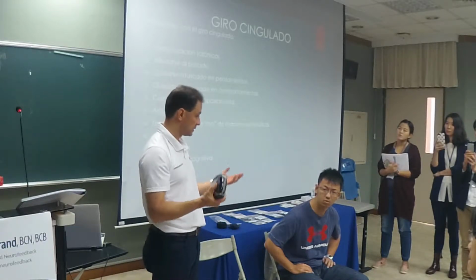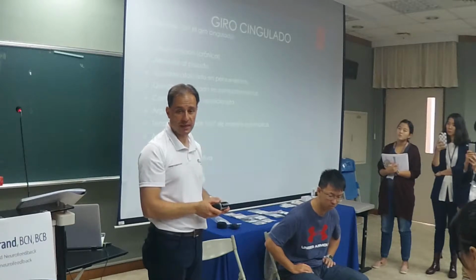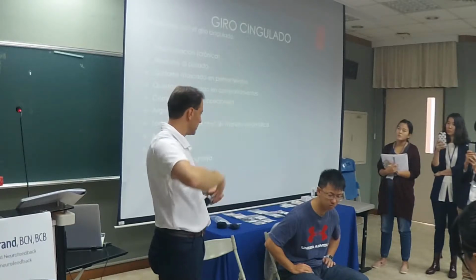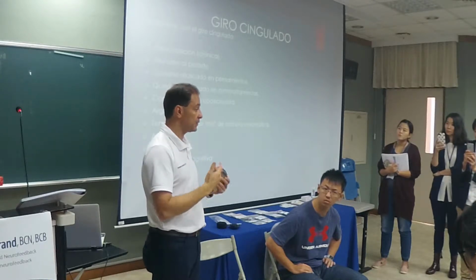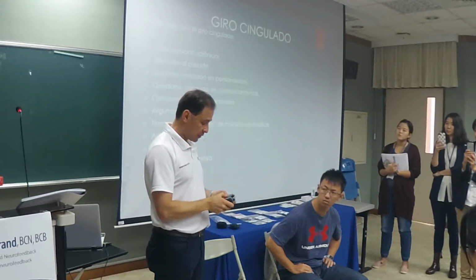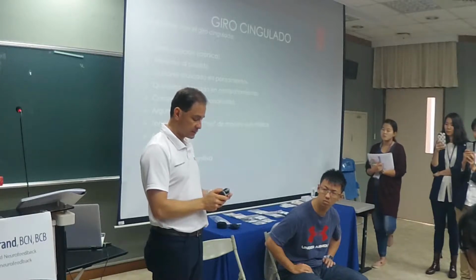Let's say you want to expose somebody who's phobic to heights. You take me to go climbing, and I take equipment with me and we go climbing and I do the recording. So it allows for that, ambulatory. So what we're going to do is the sensor placement.